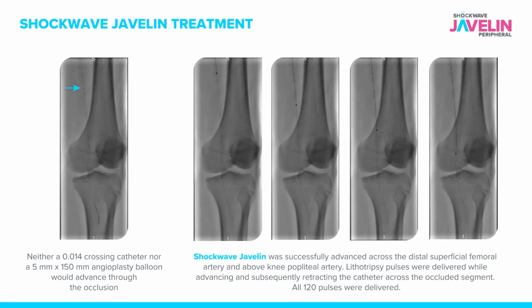At this point, I elected to use the Shockwave Javelin catheter in an effort to cross through the occluded segment, deliver lithotripsy pulses, and establish a flow lumen so that we would be set up to facilitate definitive therapy.